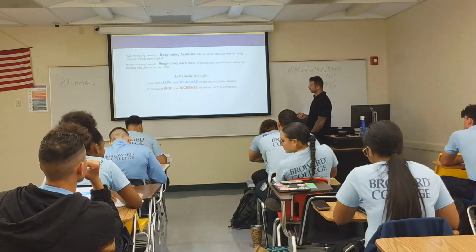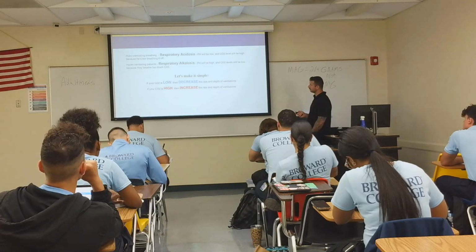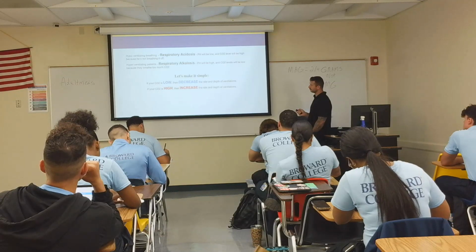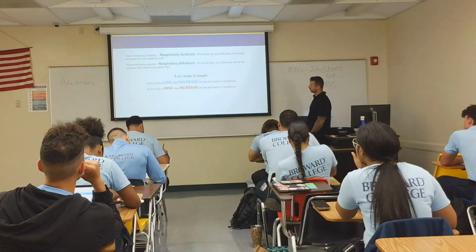Hyperventilating is the opposite, right? I'm breathing fast, my pH number is going up, so I'm in alkalosis. But my CO2 number on the life pack is going to go down. So if I'm at 20, then I'm hyperventilating.